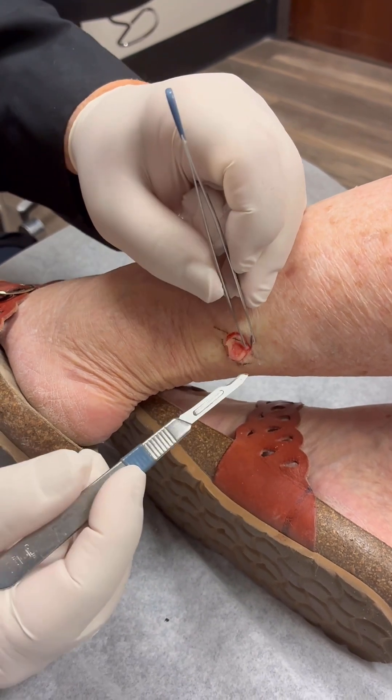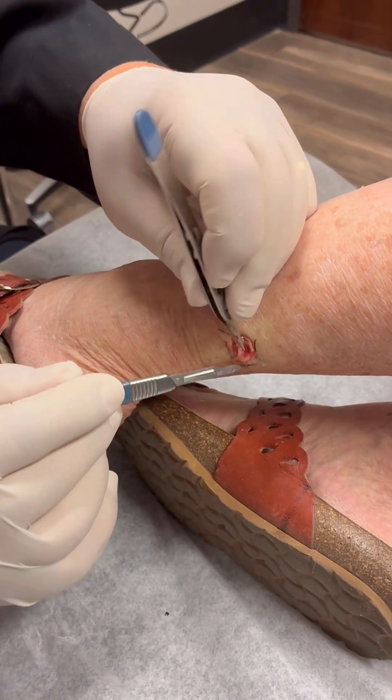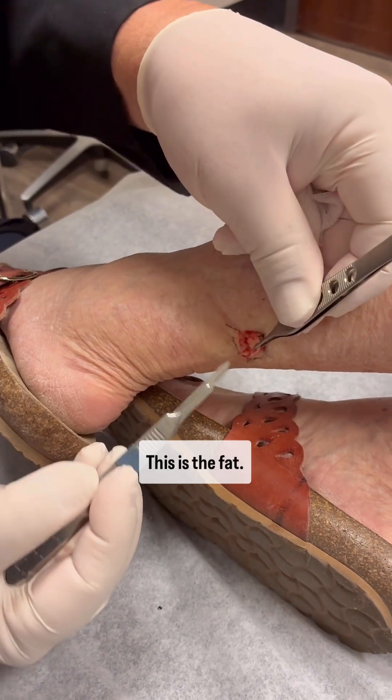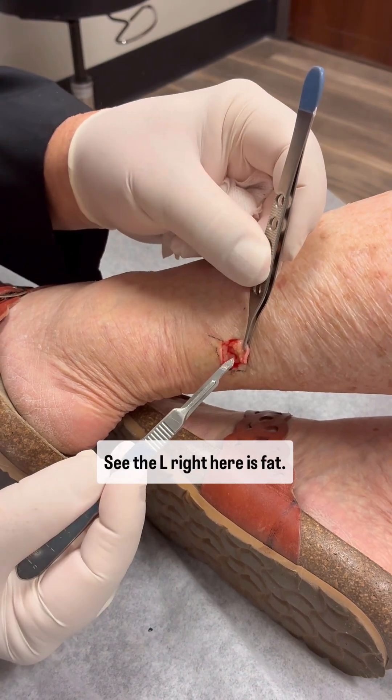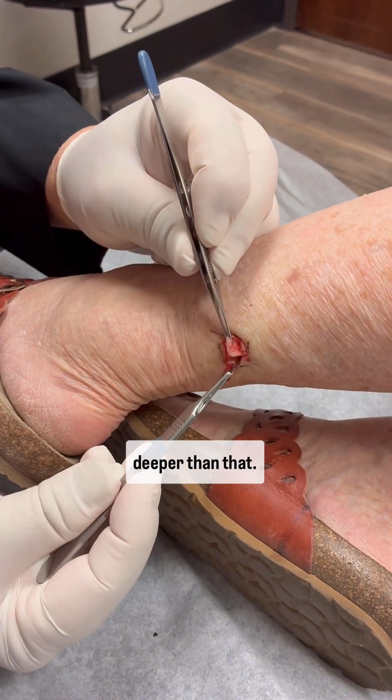I'm going to mark it a little bit. This is the fat — this is what fat looks like right there. See, the yellow right here is fat. You don't have to go any deeper than that.